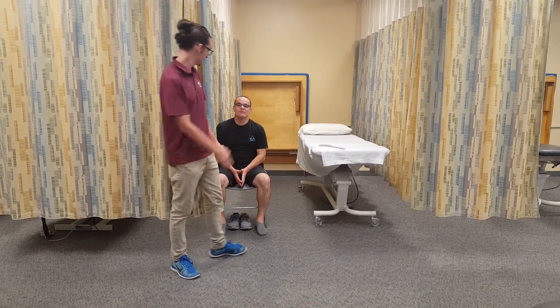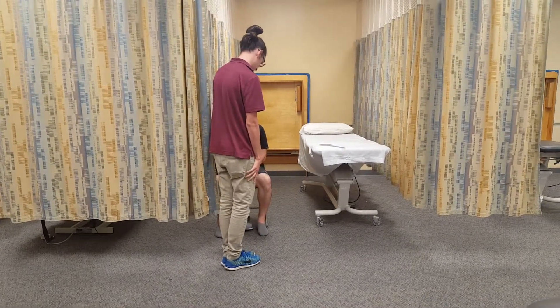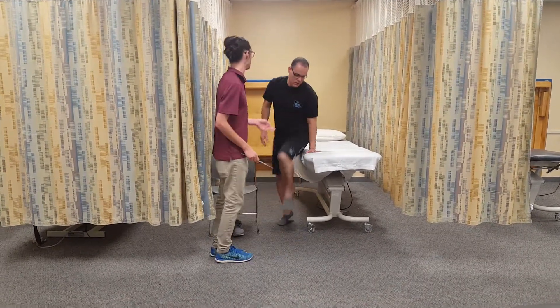I'm here with my patient Ernesto. How are you Ernesto? Today I'm going to be measuring the ability to move your leg out from this position to up here. Sounds okay? So I need you to lay down supine for me with your back.